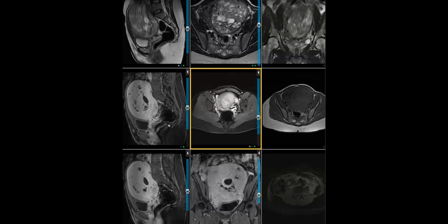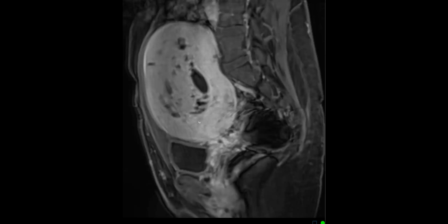So if the clinician asks, can we rule out leiomyosarcoma? What should be our answer? I think it's very hard. Yeah, it's very hard to distinguish if there is no invasion. From what I read in the literature, if there is invasion outside the uterus, that's the only way you can tell. But otherwise, if it's contained in the uterus, it's very hard to distinguish. But correct me if I'm wrong, and diffusion doesn't help.